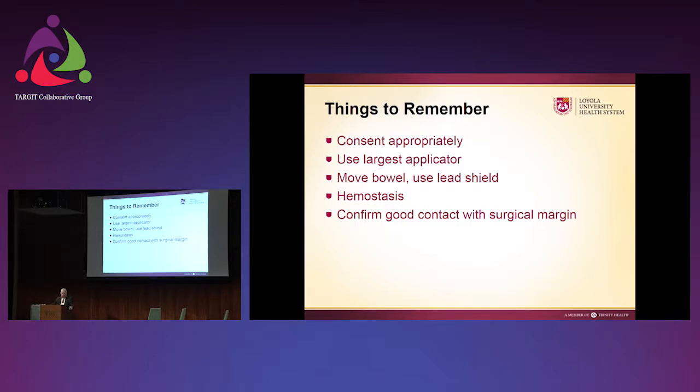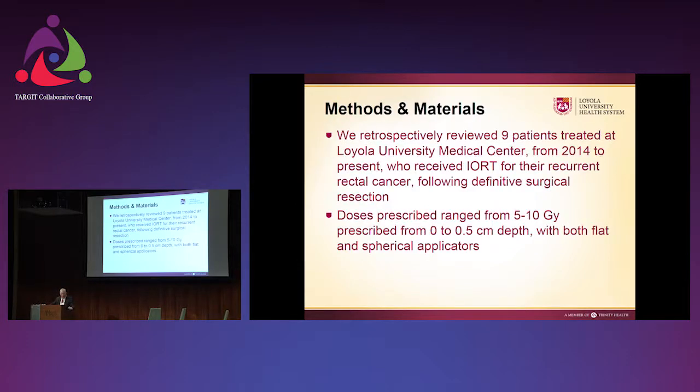Use the largest applicator you can. You can move the bowel. You can use lead shields. Good hemostasis. Confirm good contact with the surgical margin that you're treating.